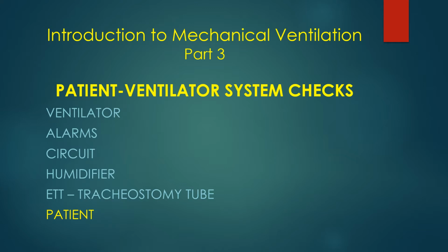Monitoring the ventilator goes by a lot of names. The correct term is patient ventilator system checks, because we're not just checking the ventilator, we're checking the patient also, and everything between the patient and the ventilator, which would be the ventilator circuit, the humidifiers, the patient's endotracheal tube or tracheostomy tube, whichever he has.